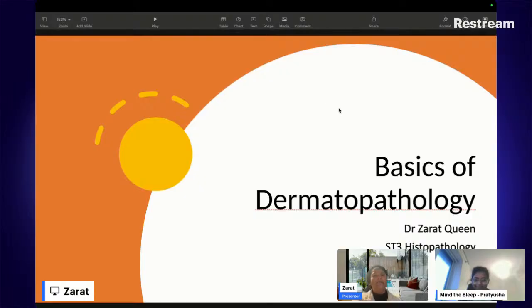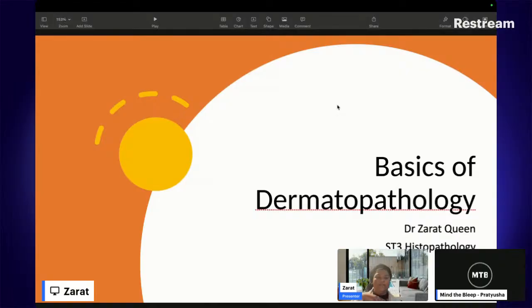So today my talk is on the very basics of skin pathology. And this basically will give you a bit of an insight, hopefully, into what we do as pathologists on a day-to-day basis. Skin specimens make up a huge amount of work for all pathologists everywhere.